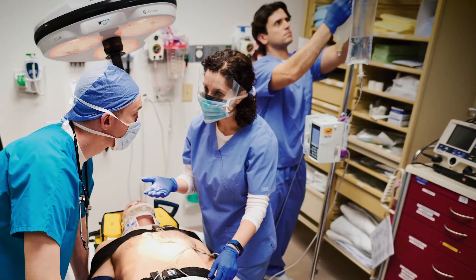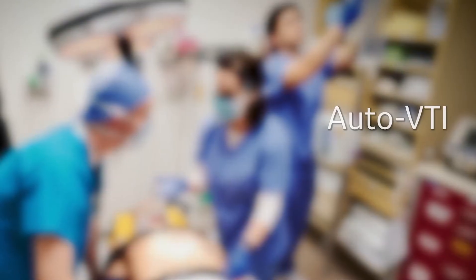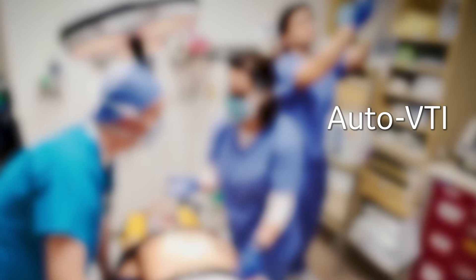When you are determining the cause of shock, you want to know if the heart is pumping enough blood to end organs.